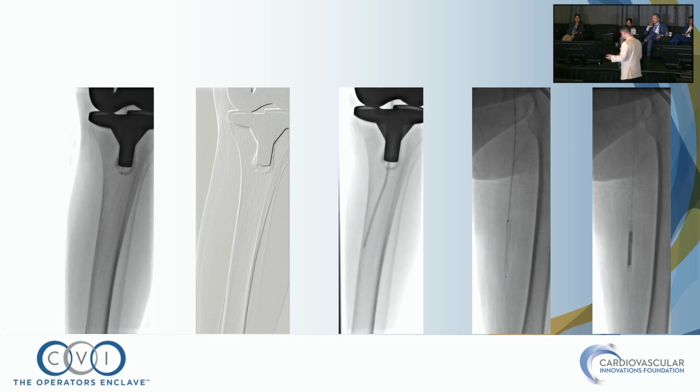But what we need to remember in these patients is that this patient had a significant SFA lesion that needed to be addressed, likely with a stent. So I was worried about the outflow, and also she's an ALI on top of CLI. She's a lady with a malleolus wound, so you need to make sure you have good flow to that territory. I'm sorry I don't have the foot angiogram prior to me attempting another thrombectomy into the TPT, but the flow down that PT was really sluggish and slow.